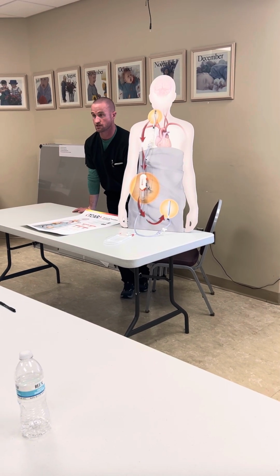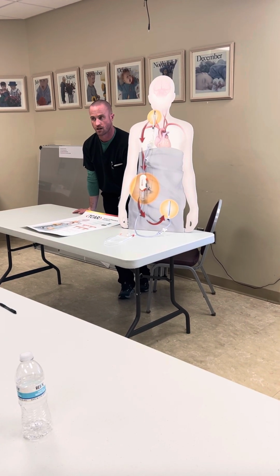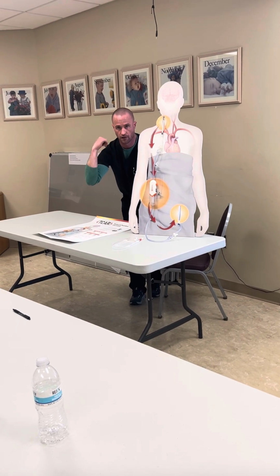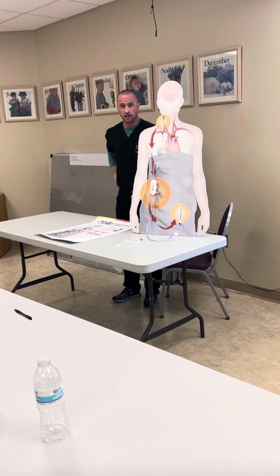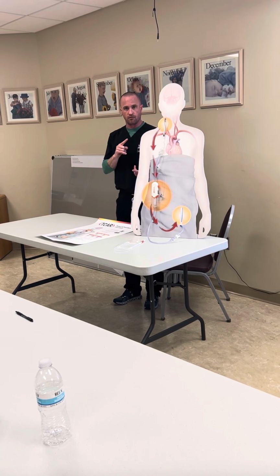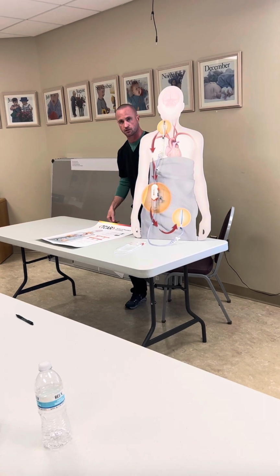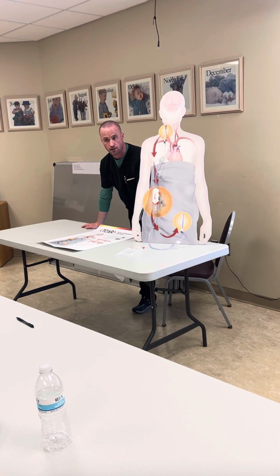At least last time I saw it, it was in the ortho room. I put it together maybe a couple weeks ago. Okay, perfect. It's got everything on it. The only thing, at the time, I think the micropuncture kits had all gone to the cath lab maybe. But I think they had everything else. Actually, today I'll do that. I'll make sure we have the extra micropuncture kits for the venous access, and then just a Benson wire or a J wire for that venous access, because we don't provide that. But I'll make sure we got those and the inflation devices on there.